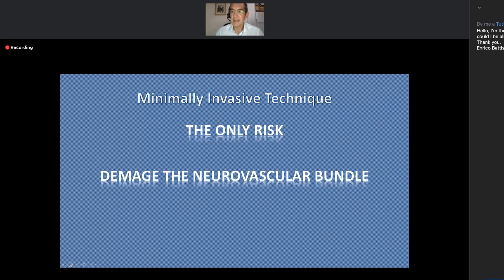Thank you. And Salah, would you agree, or would you have a different opinion? Yeah, I would totally agree. I think it is a 3-step approach, starting with malleable prosthesis. When you get advanced, you go for penoscrotal inflatable prosthesis, and the infrapubic approach is the most luxurious, the top end one. You should have really good hands on the penoscrotal before you embark on the infrapubic. I would say 30 to 40 cases is fair enough.